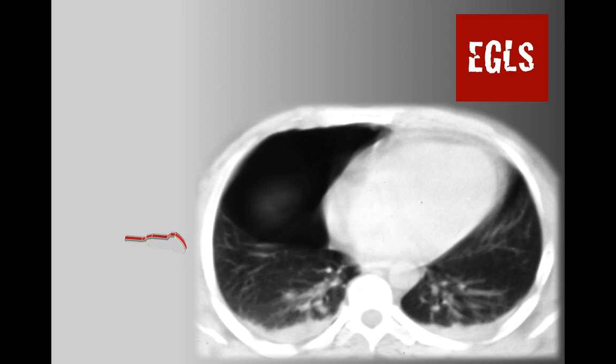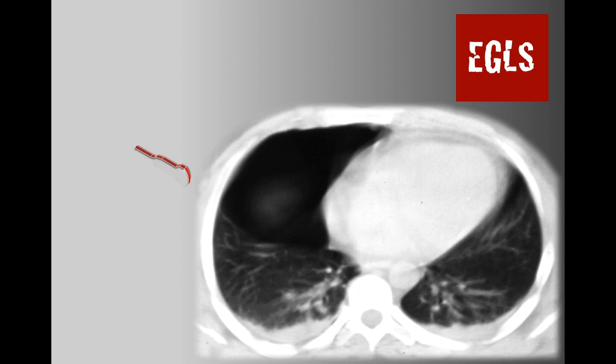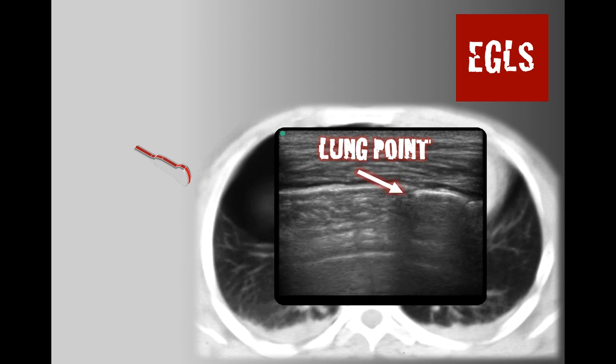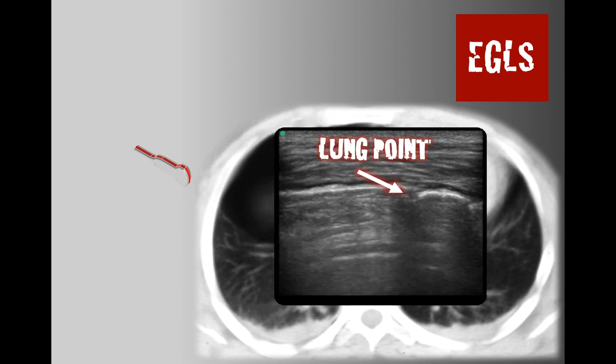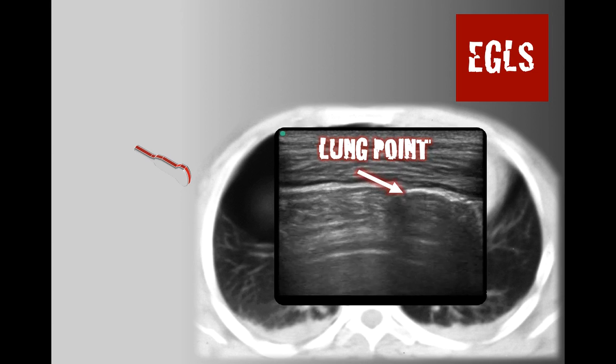Over normal lung, I should see normal lung sliding, I guess. Great. Now, if we put the probe at the exact location where both pleuras separate, what will we see? Well, when the patient breathes in, the lung will inflate. It will thus come into the ultrasound field of view. And as the patient exhales, it will tend to go out of the ultrasound field of view. So you'll see it coming in, going out, coming in, going out.